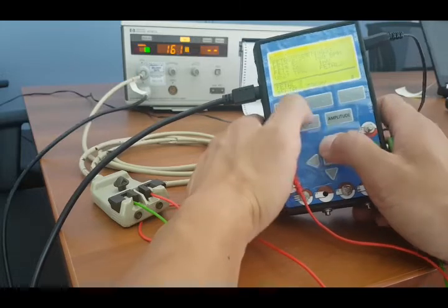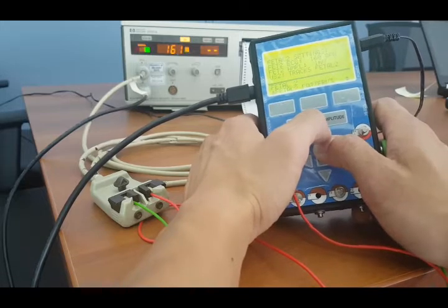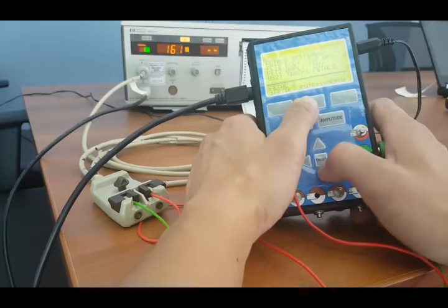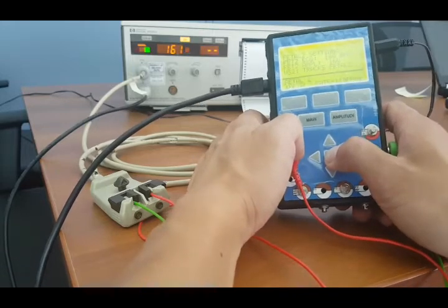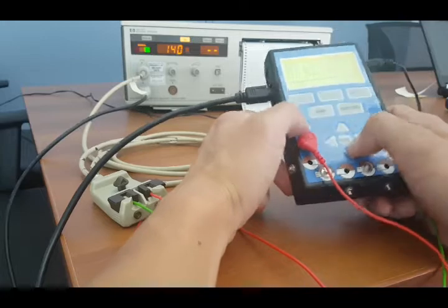I can change the rate. As well, I have some additional waveforms available within the fetal 2 group that are not available within fetal 1. It's going to continue to read 160 until I physically hit enter here on the bottom. And now I have selected 140 beats per minute, and my monitor is reading 140 beats per minute.